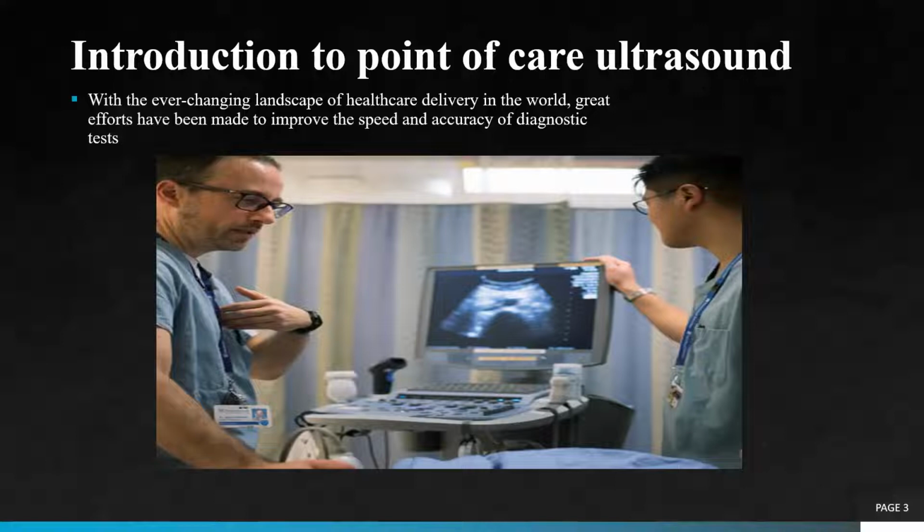in point of care as an ultrasound examination performed directly at the bedside by a healthcare provider to answer a specific diagnostic question or direct the performance of a surgical procedure. What is the difference between point of care and bedside ultrasound? There is a slight difference between them.